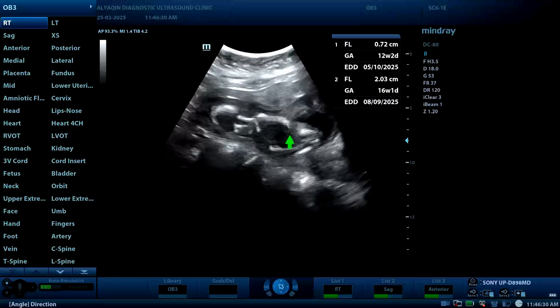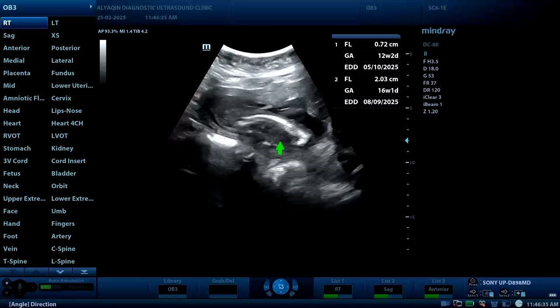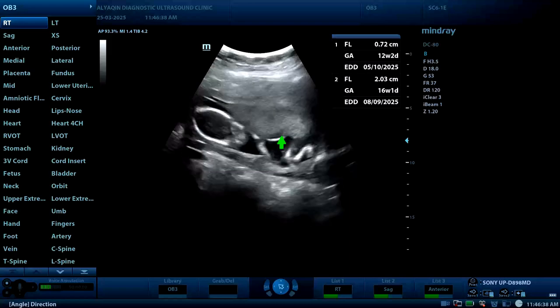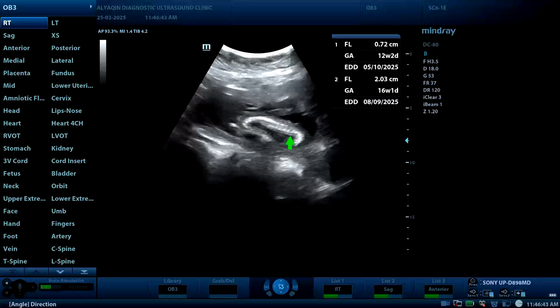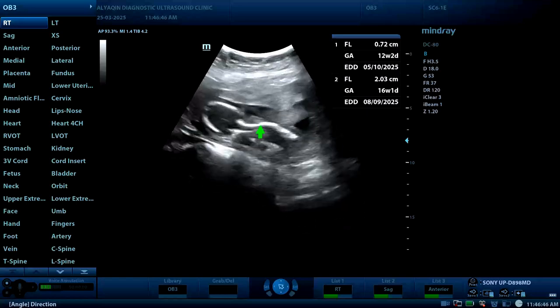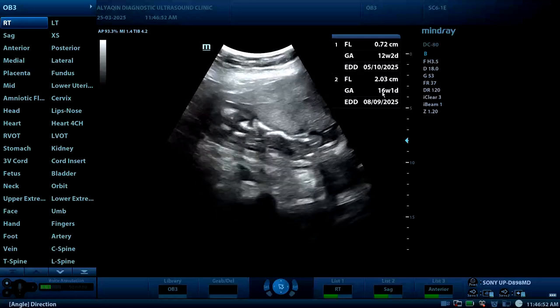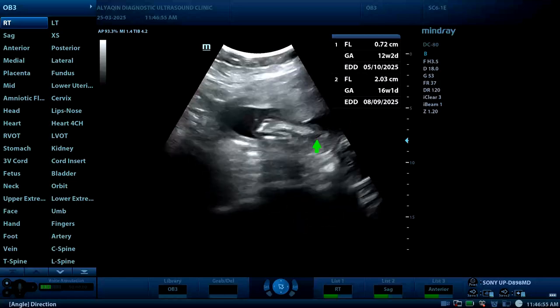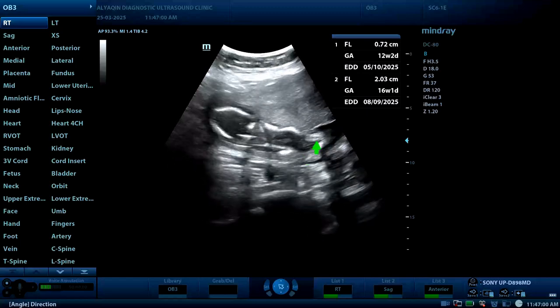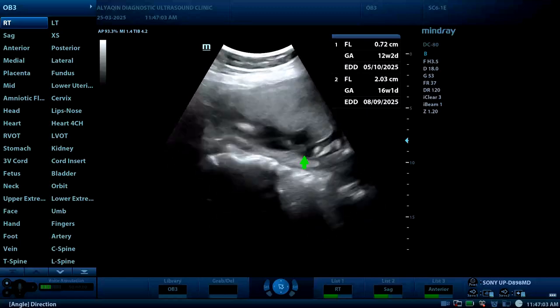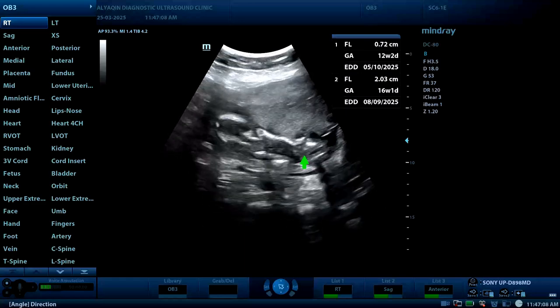Oligohydramnios is also noted, and some cystic changes are also detected inside the fetal abdomen. Those are the main findings of intrauterine fetal death. The gestational age is 16 weeks. Thank you very much.